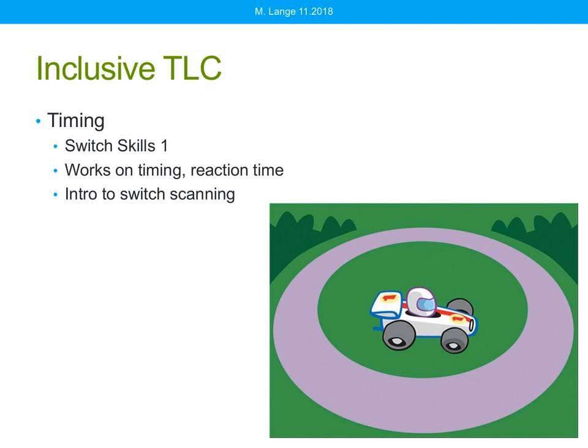So in their timing category, one of the software programs that I like is called Switch Skills 1. It helps work on timing, reaction time, and provides kind of an introduction to switch scanning. So we're not actually scanning through options using a program like this, but we are starting to build timing.